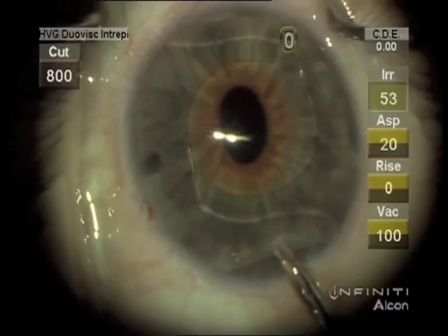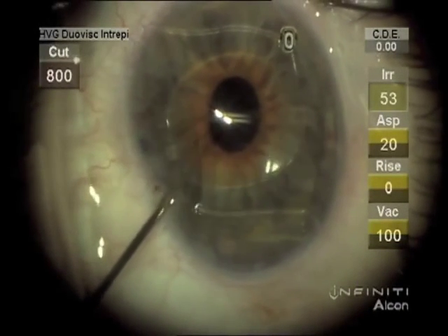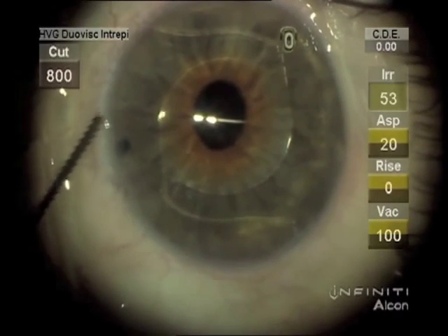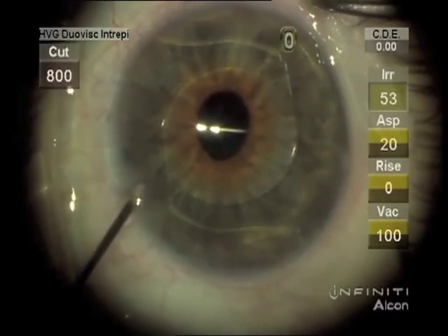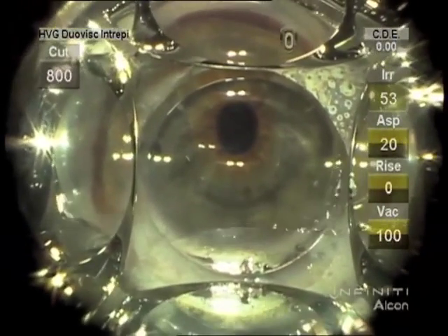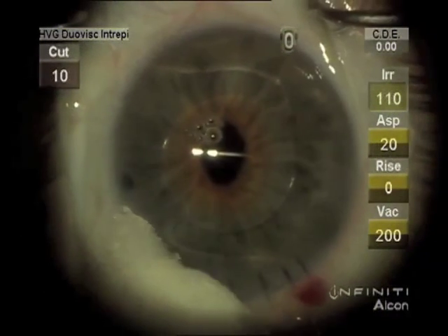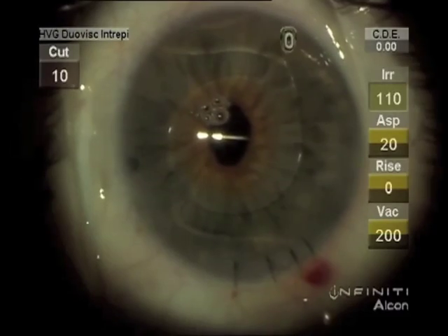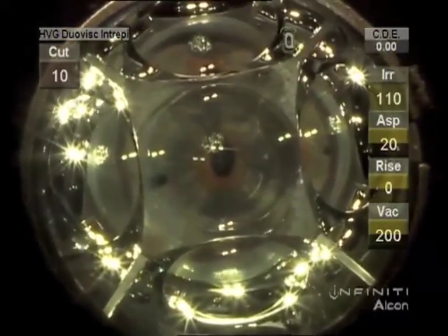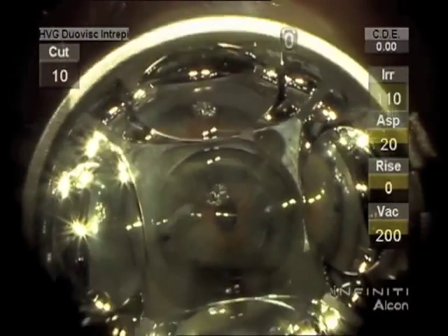Then get the trailing haptics inside the incision one at a time. The chamber is reformed. I like to have a gonioscopy lens on the table, sterile and ready to go, to check the position of the haptics in the sulcus. If this is not available, use a Sinskey hook and pull the haptics out of the sulcus — lift a little bit and let it settle back into the sulcus. After the wound is closed, we're checking again to make sure the haptics are not tucking the iris and are positioned properly.